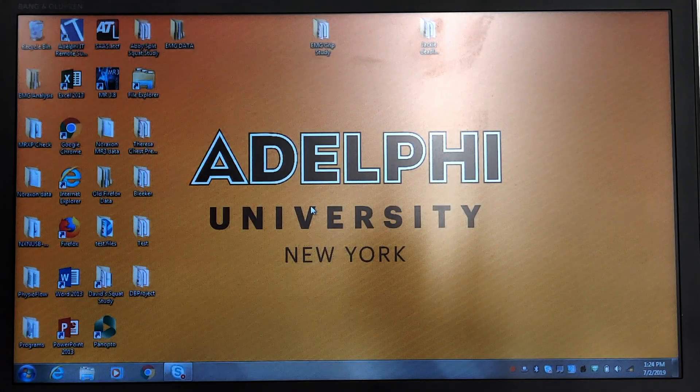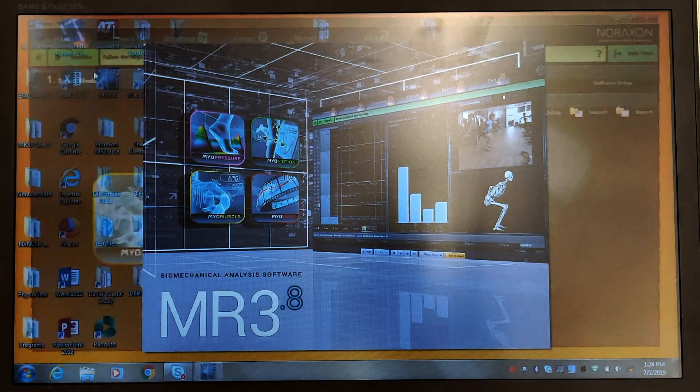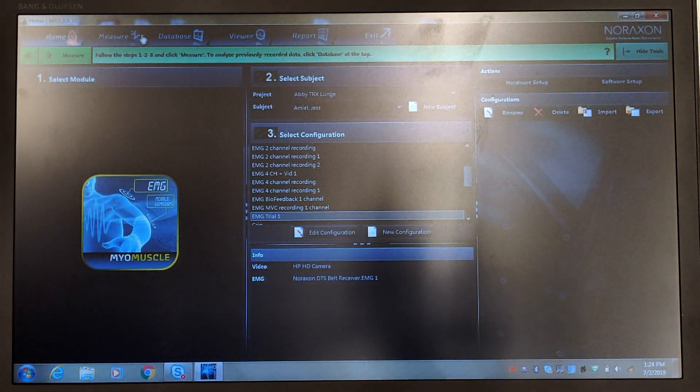Before we get started we need to start our software. We'll come over here to the top left and hit MR3.8 — this is our analysis software for our EMG unit. The next thing we'll do is go to the top and choose the third option from the left, which is Database.